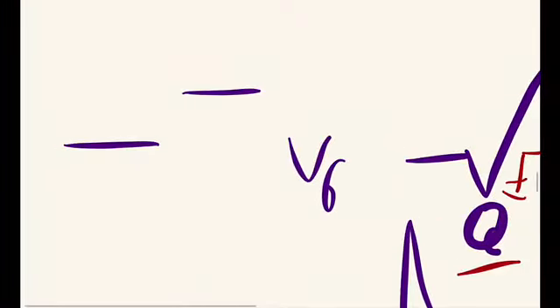That is the thing which is happening here. The ST segment is not elevated, but the proximal part of the ECG, which you can say is the PR interval, is below the normal line. And that is giving us the effect that there is ST segment elevation. Now, what is the concept behind this?